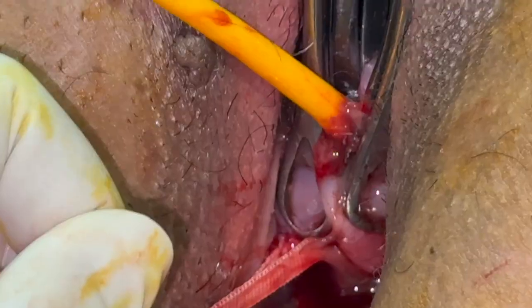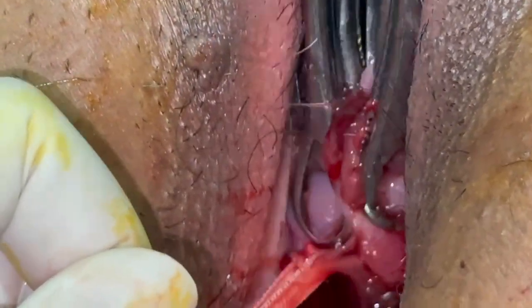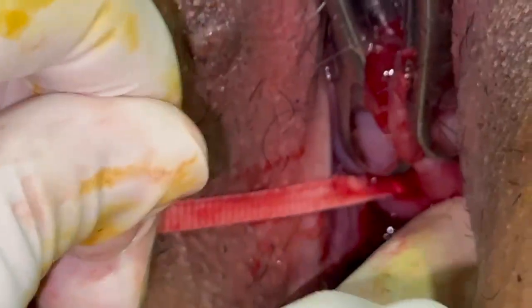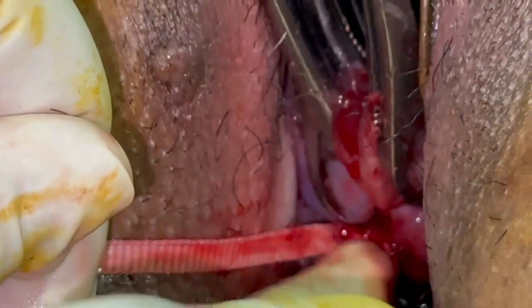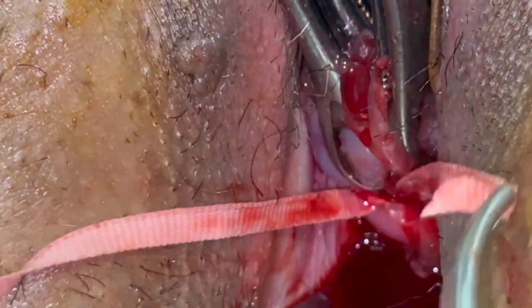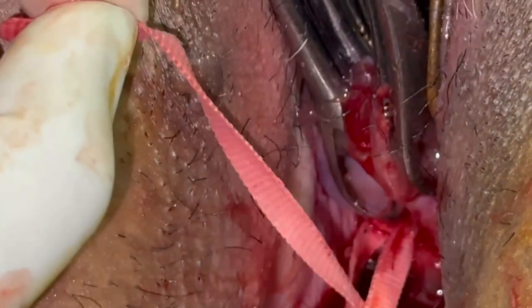So here we have tied the knot, and then we are removing the catheter from inside the uterus. Now we are tying the knot tightly. As this was a very dilated cervix, it was a little difficult to place the knot.